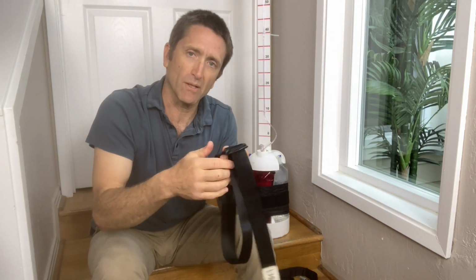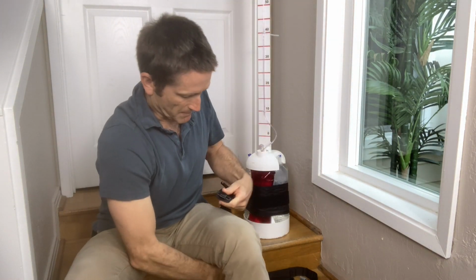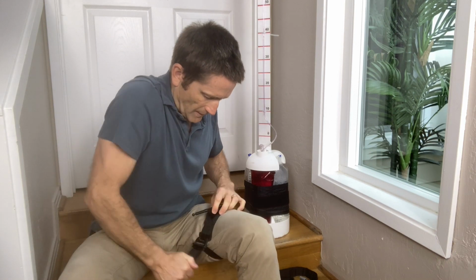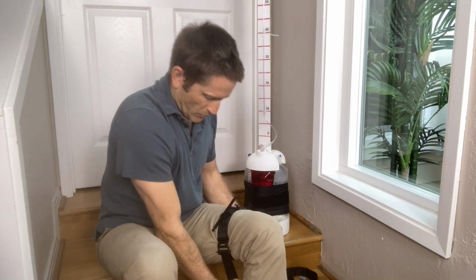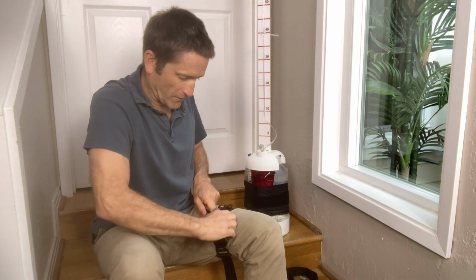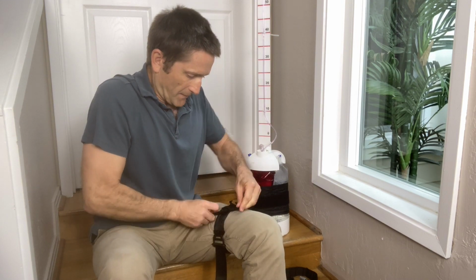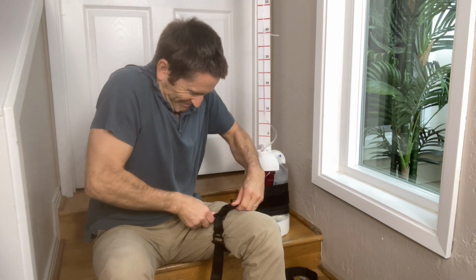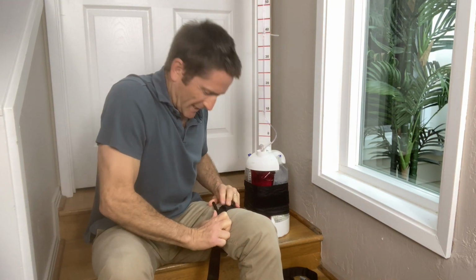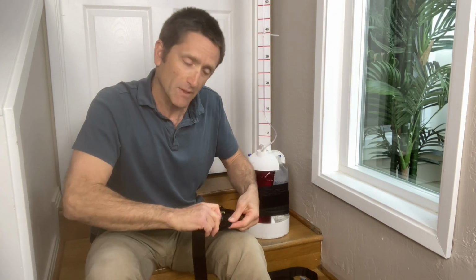And actually, let's show what it looks like on my leg. I really could not get that many turns on my own leg. So I set it to here. Make that tight. How many twists can I get? Trying to make that first very tight. So call this 1, 2, 3, 4. I can barely get to 4 twists. So with the tourniquet runway, you have a limited number of twists.